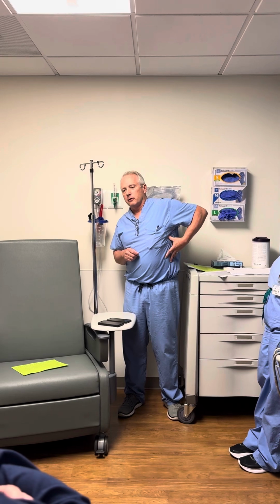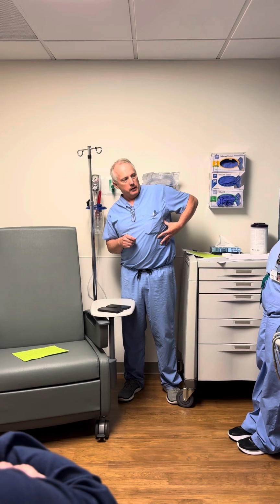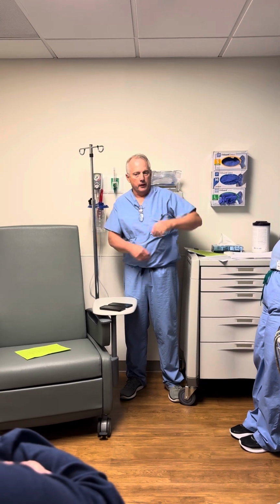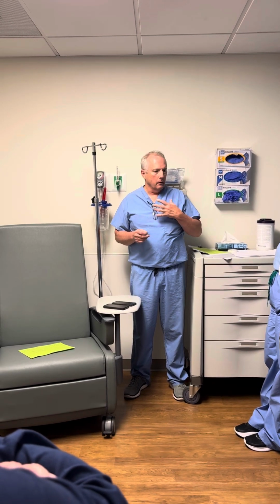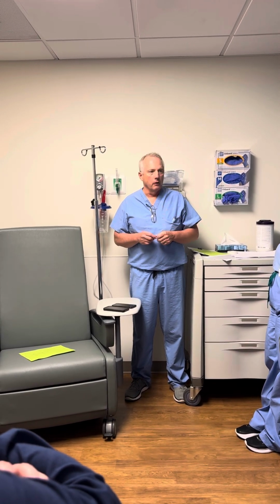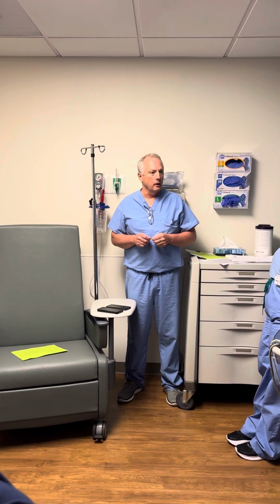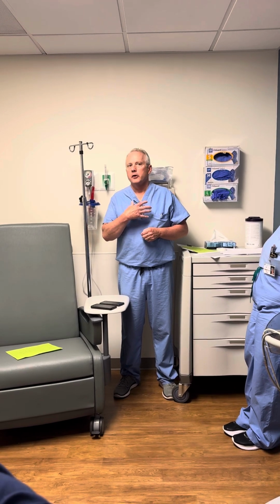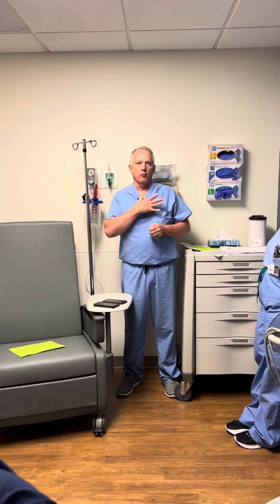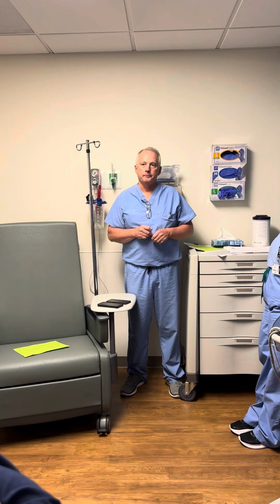Or you have subcutaneous ICDs that are implanted. The device itself is right here, on the side. Other than that, we now have devices that are leadless, and that takes on a whole new realm. Ours isn't out yet, so I don't know what they do, but I imagine they would have to be programmed, because I just don't think a magnet would be strong enough to elicit a response through all the tissue and inside the heart. But I don't know that you've run into that yet.